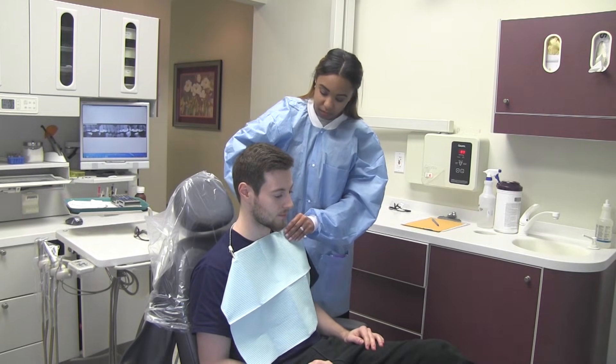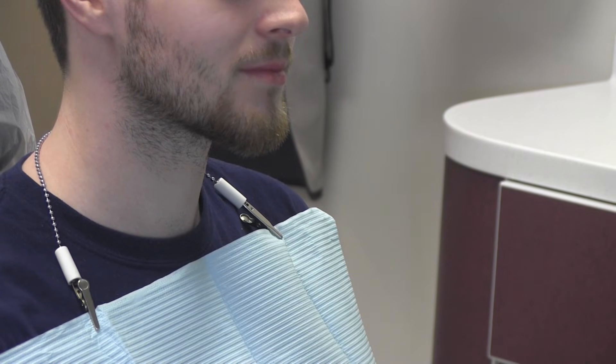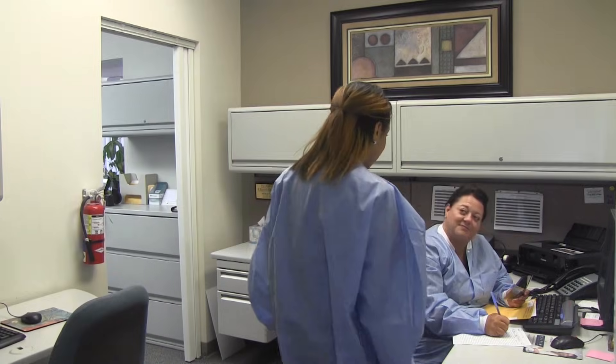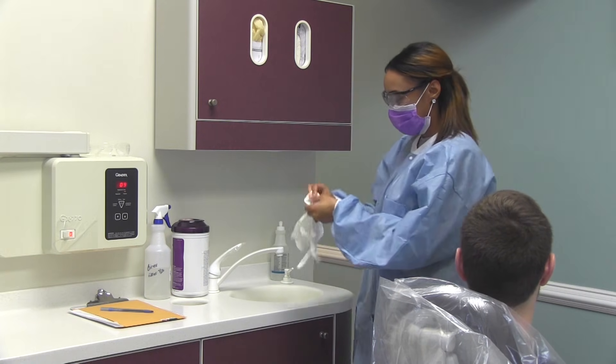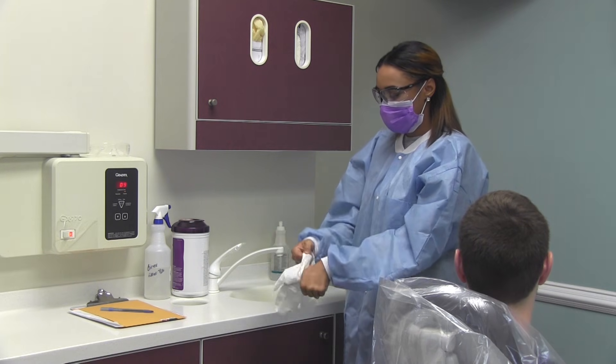Drape the patient by placing a napkin or bib and fasten it with a clip. Inform the dentist that the patient is ready for the procedure. While you wait for the dentist, wash your hands and put on your PPE.